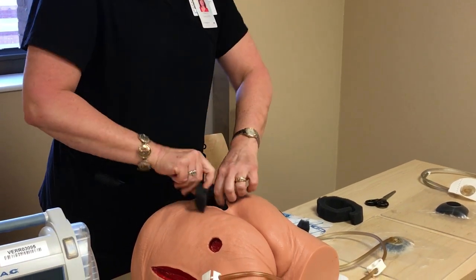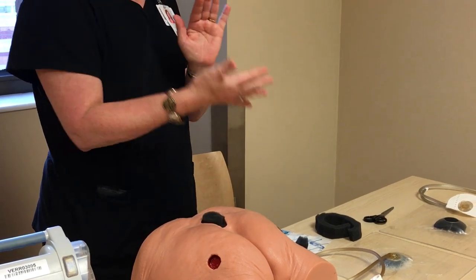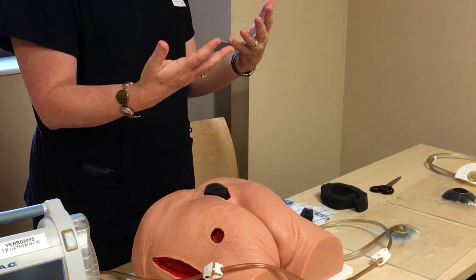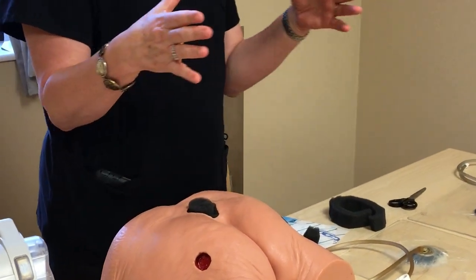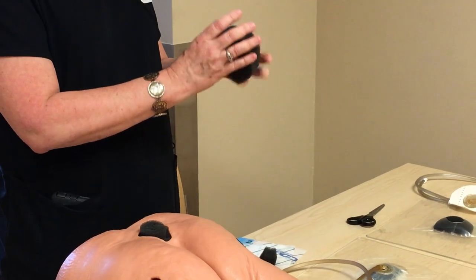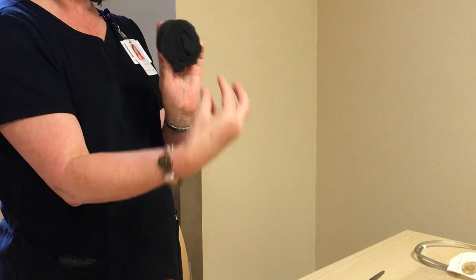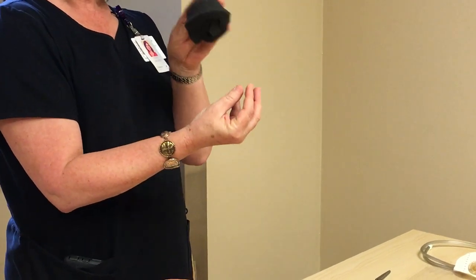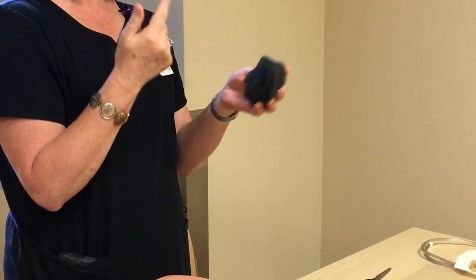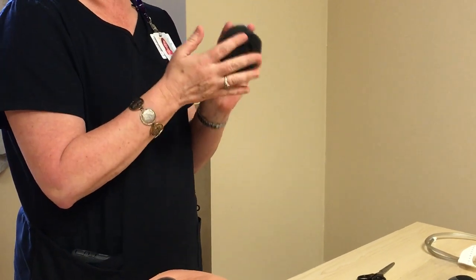What this foam is doing inside your wound is it's removing infectious material, it's reducing the edema of the wound bed, which is increasing the perfusion or blood flow to the wound, and it's also bringing those wound edges in. At the bottom of the wound, it's actually doing something we call micro-strain, where it stretches the cells of the wound bed up into the struts of the foam, causing those cells to stretch, which causes them to proliferate, and you get that rapid granulation tissue.